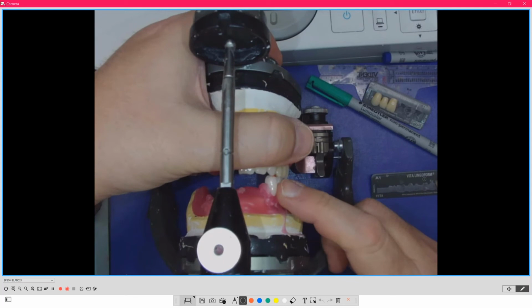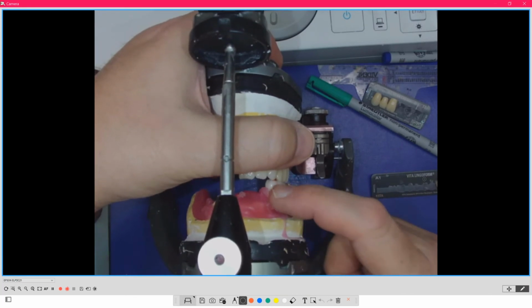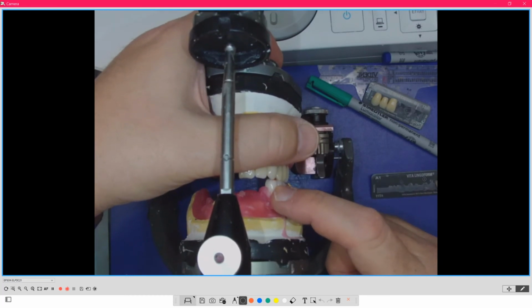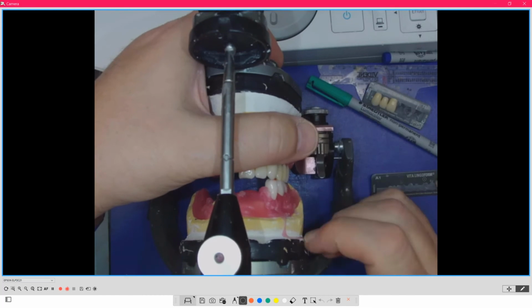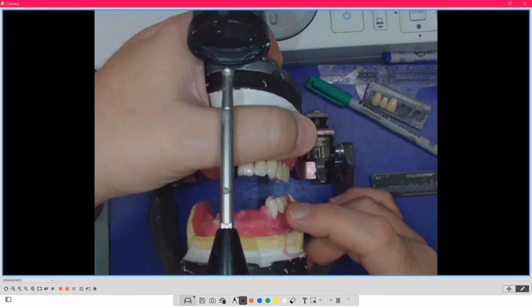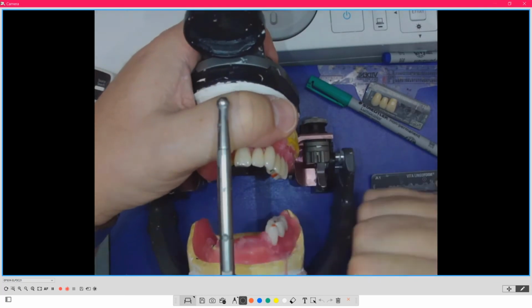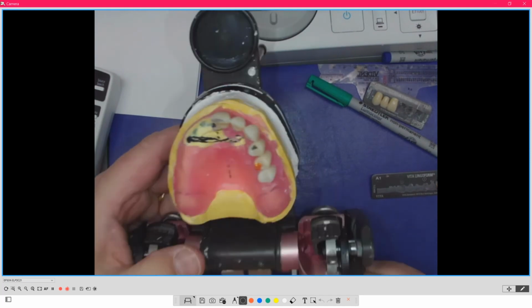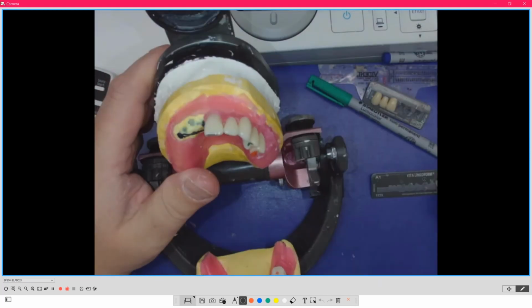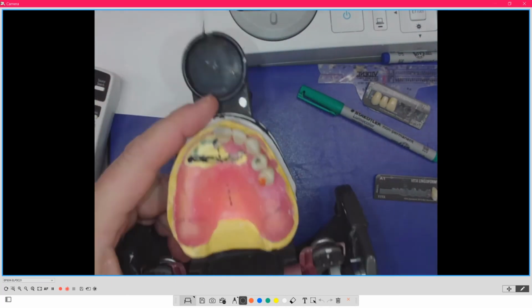Okay, this is in, so it's not going to push on the lip. So I'm on the inside part of the fossa on that corresponding tooth. Good. So it allowed me that flexibility. I didn't have to grind anything yet. And now I've got lingual cusps in fossas here to hammer the food and crush it. So I can take whatever and put it in there. So let's take this out. And now I'm going to throw for fun. Let's show you what we can do.